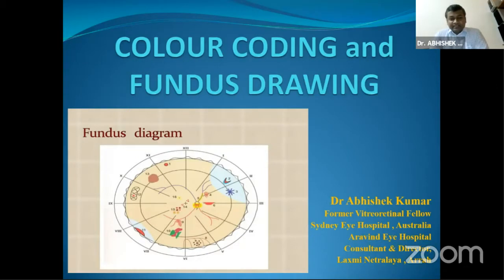This is an important topic for the day because fundus drawing helps in comparing the changes in pathology on follow-up visits, and it also helps our teammates and others to understand the pathology better. Just by giving a glance at the fundus diagram in a busy OPD can give us a lot of information. There are various advantages associated with it: it's less expensive than a fundus camera, and at times it may be difficult to get all the information on the fundus camera because of the levels of lesion. So we can draw all the lesions beautifully in the fundus diagram, and it is also helpful in medico-legal cases.